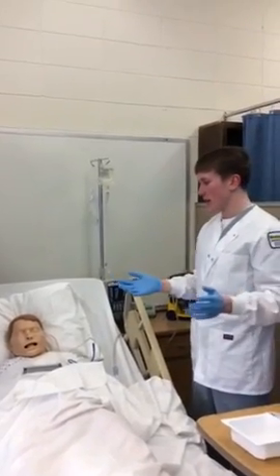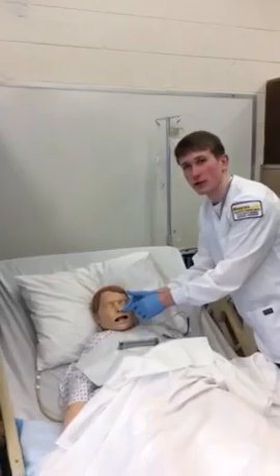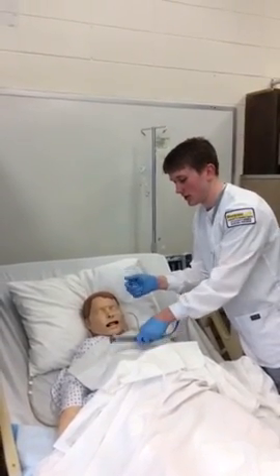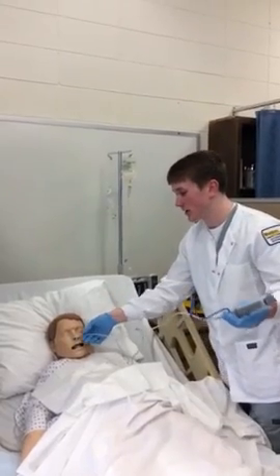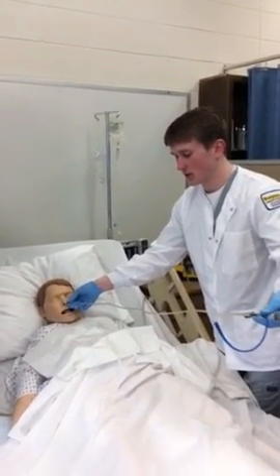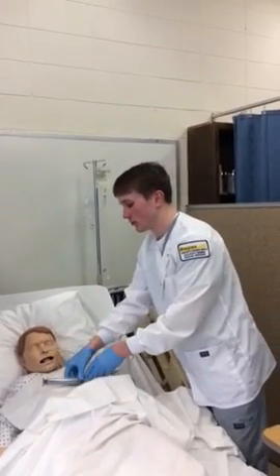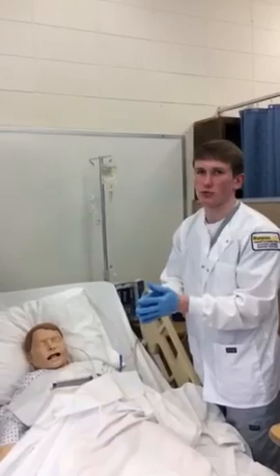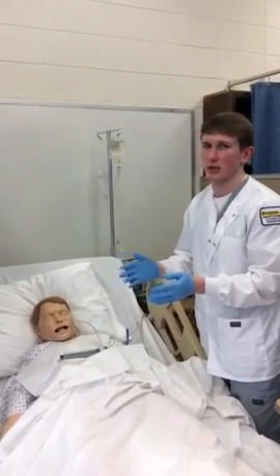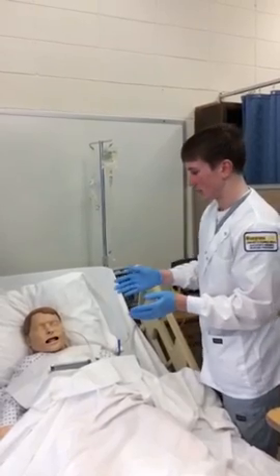So once the x-ray has been done, I come back and verify that the tube marking is still where I left it. And I don't have a measuring device right now on me, but I would measure the amount of tube that I have exposed. And also for NG tubes that were placed in gastric surgery, I would not reposition them at all, or else that could rupture the suture lines in the stomach.